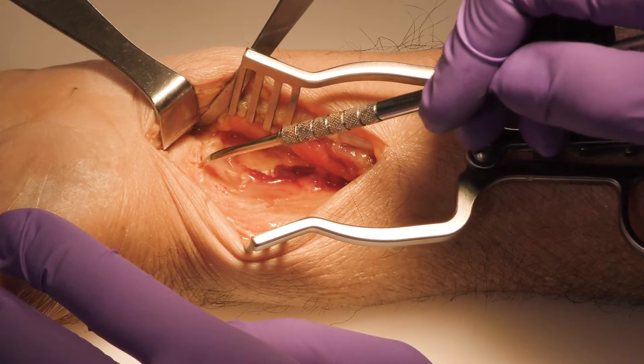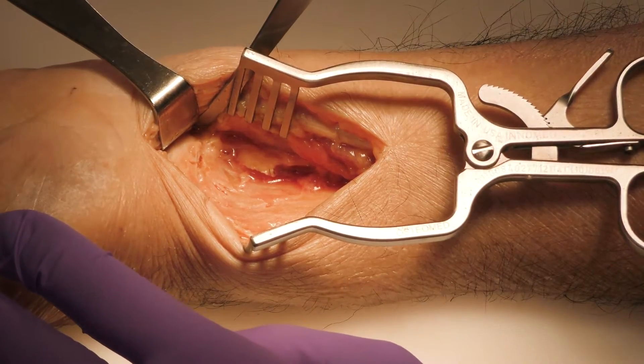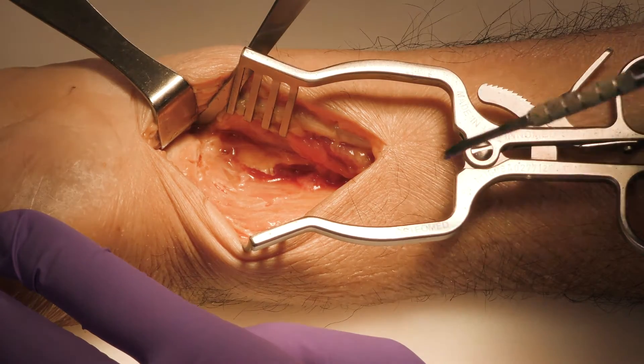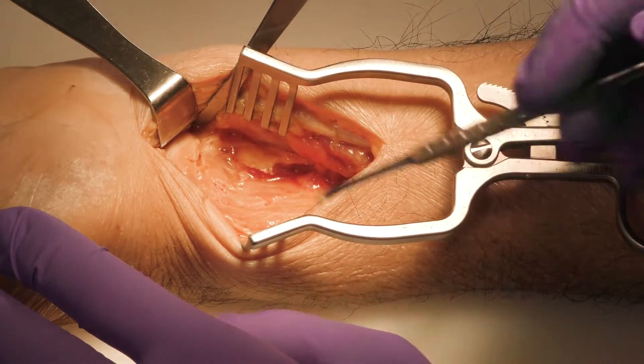Hi, I'm Dr. Steven Niedermeyer. I am an orthopedic hand and upper extremity surgeon working in Dallas, Texas. Today we are here discussing the utilization of the 0.8 millimeter avulsion hook plate in the setting of distal radius fractures.